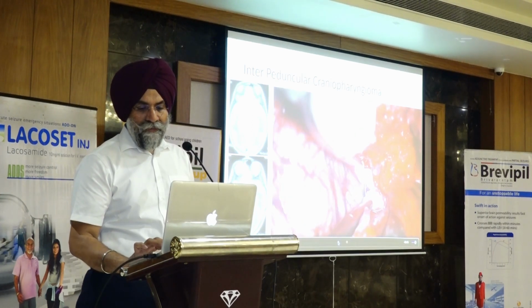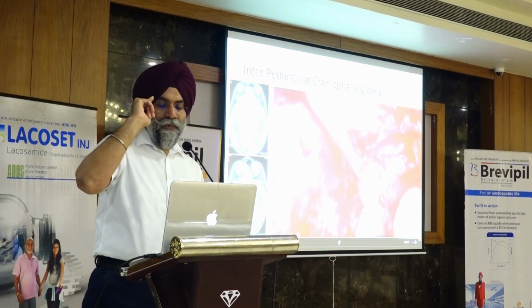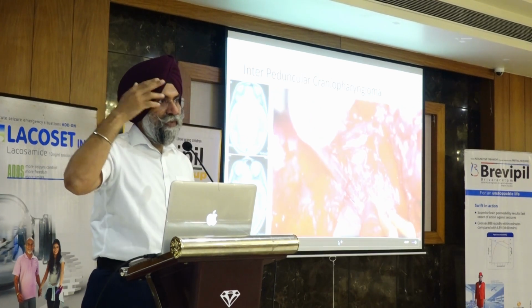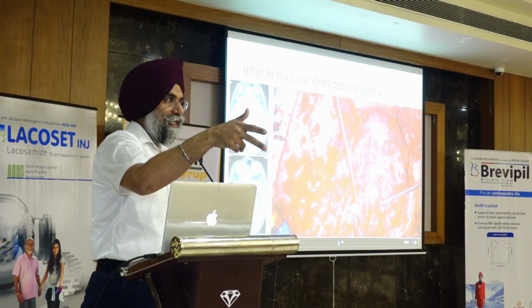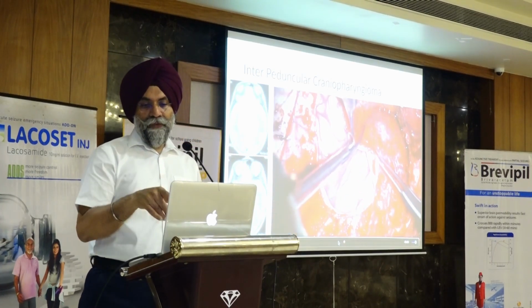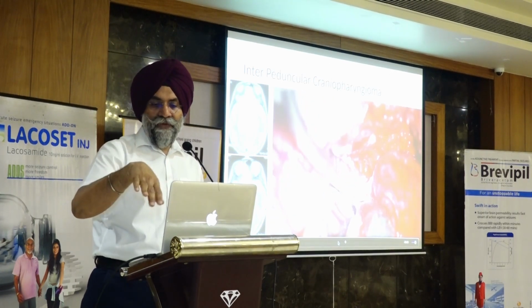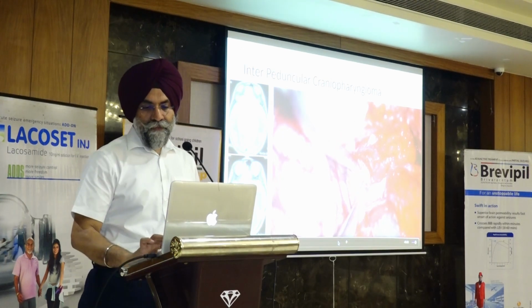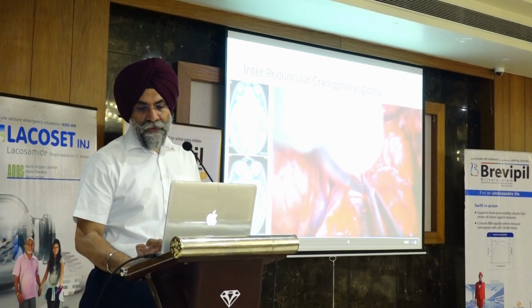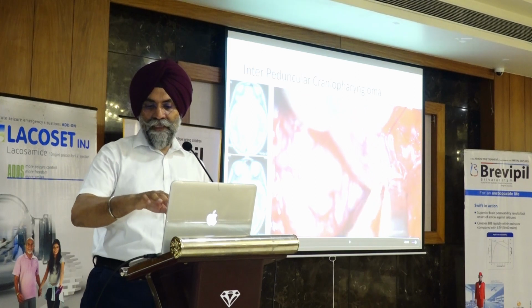So what we have to do here is the usual curvilinear frontotemporal incision, like pterional. After that we give a T incision from the middle part along the Sylvian fissure till the anterior clinoid process, so that we separate the frontal lobe from the temporal. This is the T junction incision, so that the temporal lobe is separated and lifted along with this dura posteriorly. You see that this is the one leaf of the anterior part of the dura. Now this dural separation will continue posteriorly till we feel that it is enough for us.